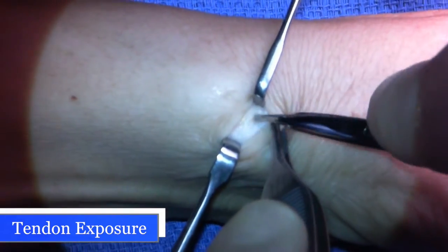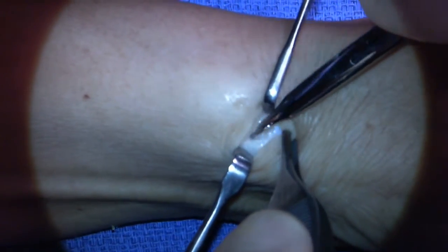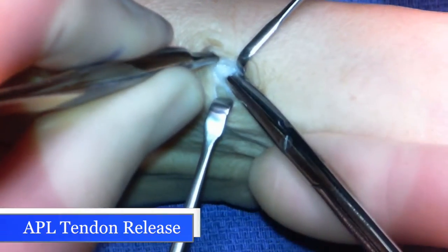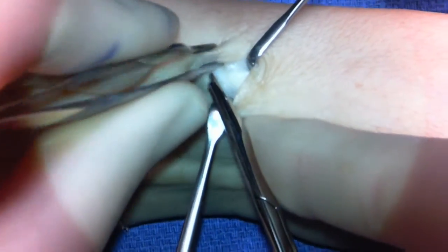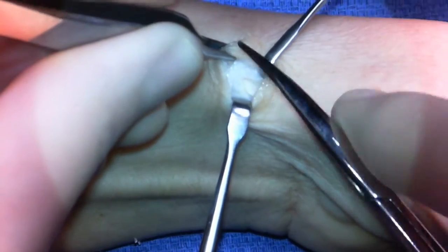I'm exposing the abductor pollicis longus and extensor pollicis brevis tendons distal to the sheath. Now I'm just running my scissors along the sheath to open the first dorsal compartment.